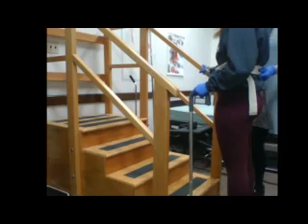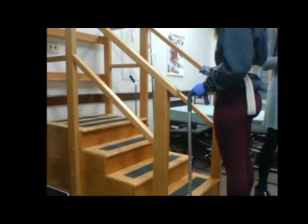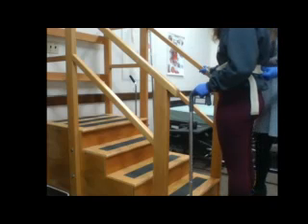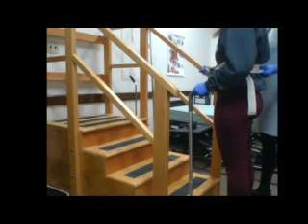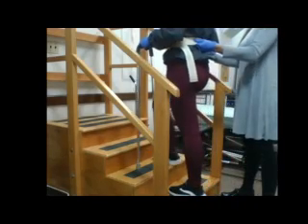With the cane, whenever we're going up the stairs, it is not as important whether they take their foot up or the cane up first, as it is with some of the other assistive devices. So sometimes it's going to be dependent on what the patient feels comfortable with. When we're helping someone up the stairs, we are going to stay behind them and slightly to the side if possible on their weaker side. So what I'm going to have you do is go ahead and put your cane up first, and then your right leg, and now your left leg. Go ahead, cane, right leg, left leg.